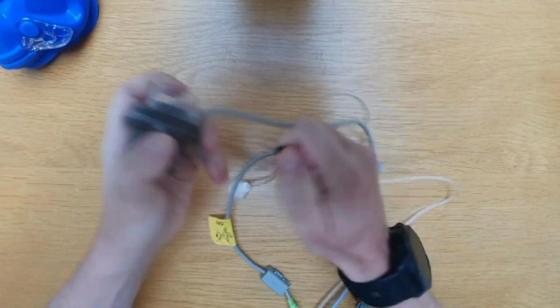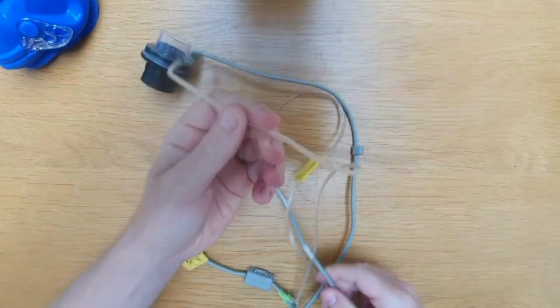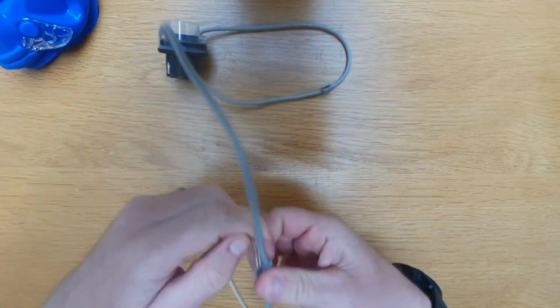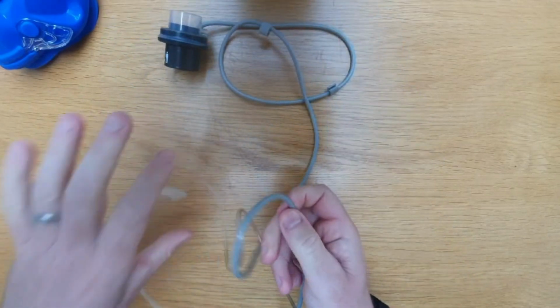Once this is done, pull out the black PermaPure connector from the flow meter head. You can then begin detaching the PermaPure cable from the flow meter. These are connected along the length of the cables.